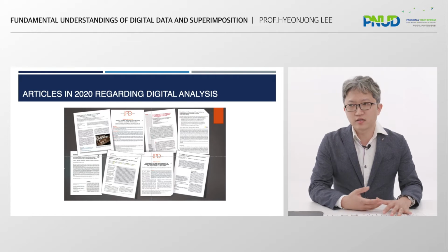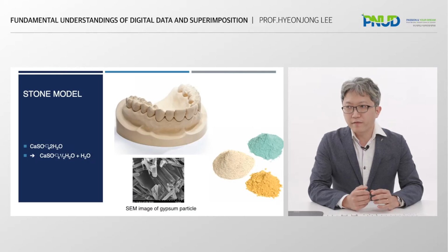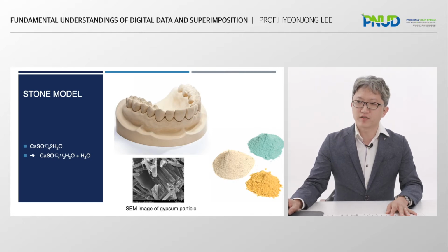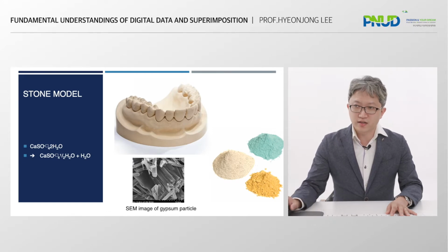So many dentists don't know about the 3D digital model, what it consists of. Actually, we are familiar with this kind of stone model made of dental gypsum. It's not that difficult to understand this dental stone, because we can grab it and touch it. And we studied its chemical formula in the lecture on dental materials a long time ago, I guess. As you can see, this is the dental stone. This is an image of gypsum particles and various colors of gypsum powders. We know this is the dental stone.